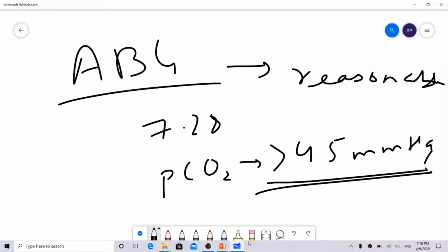means the patient is basically in respiratory failure. So we do not try to wean a respiratory failure patient. We are not very happy to wean these patients, because then they can go into more difficulty. Even on a ventilator, if they have a PCO2 more than 45, then you can imagine that when you take these patients off the ventilator, their PCO2 will go up, especially in the setting of an acute condition. So then you need to be very sure.